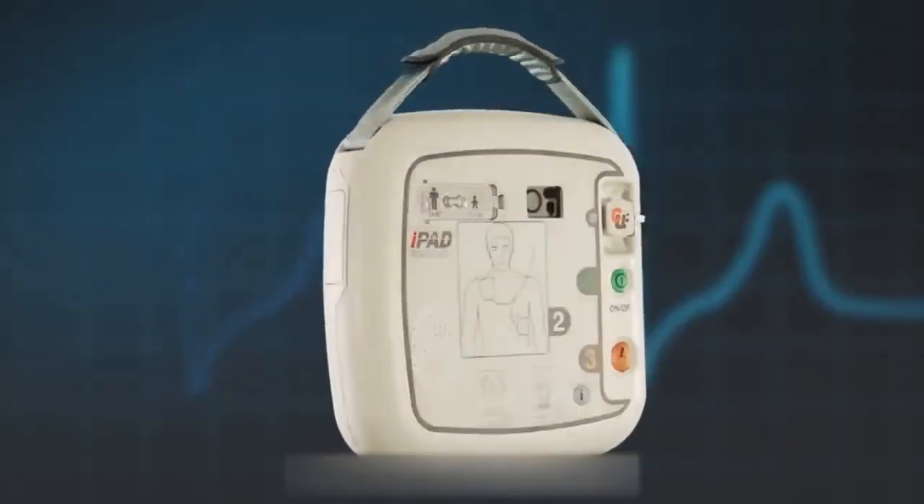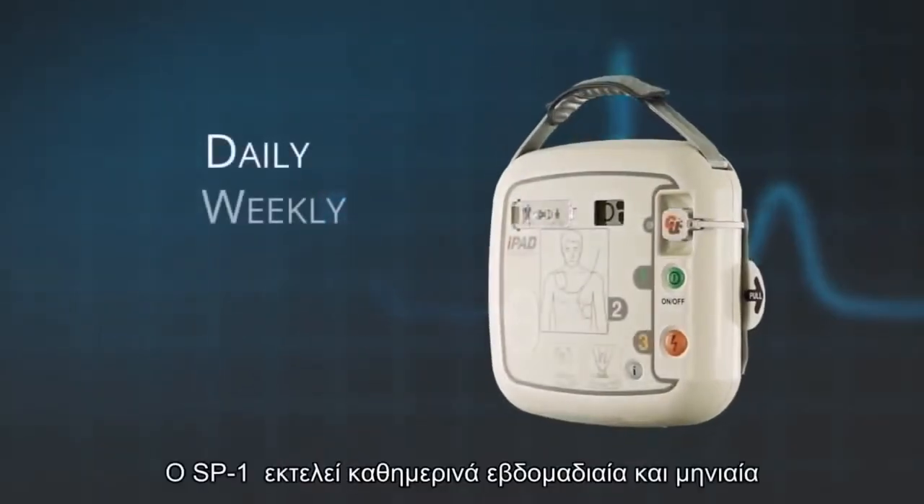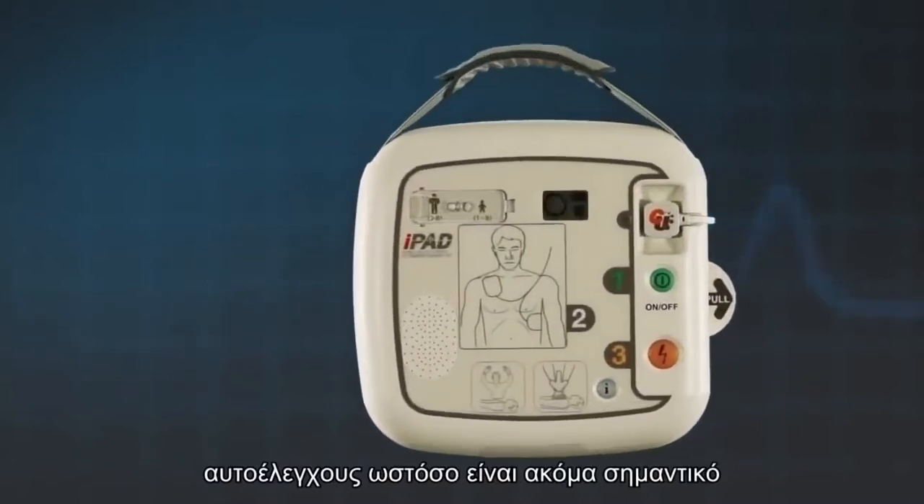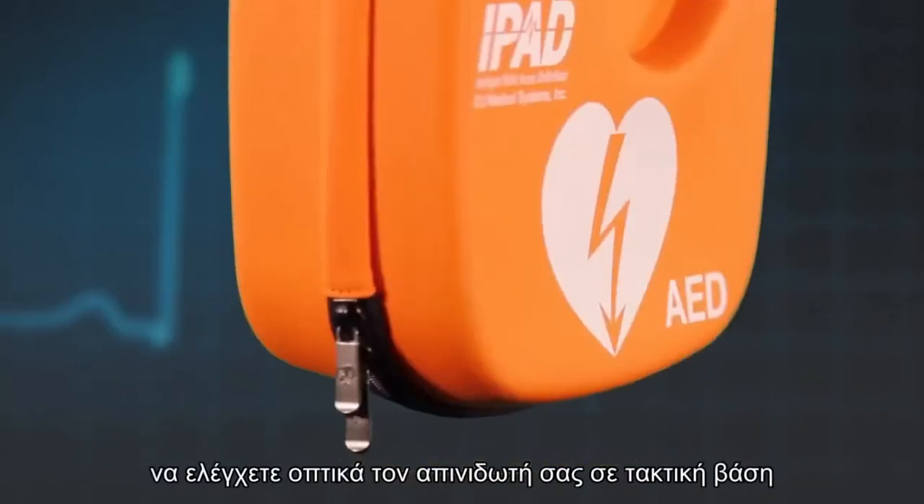The iPad SP1 AED performs a daily, weekly and monthly self-test. However, it is still important to visually check your AED on a regular basis.